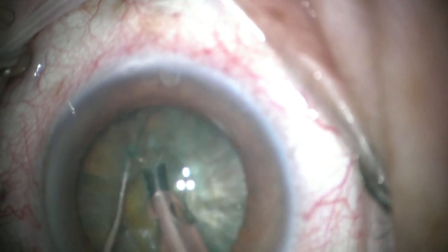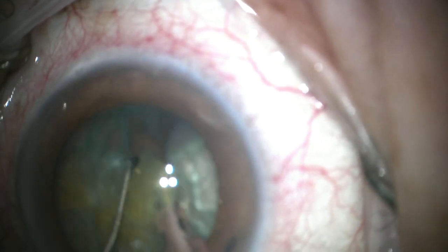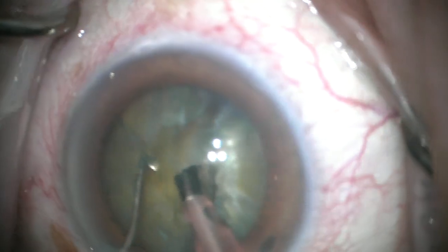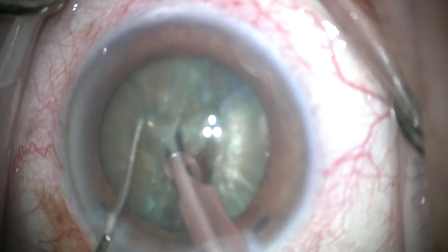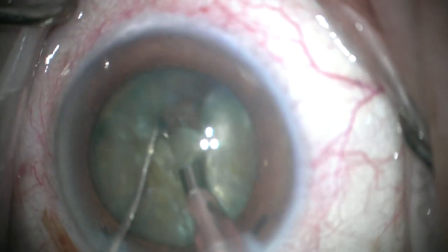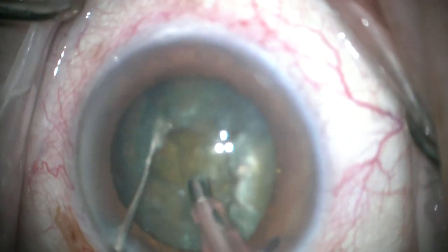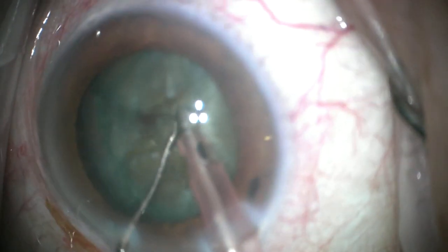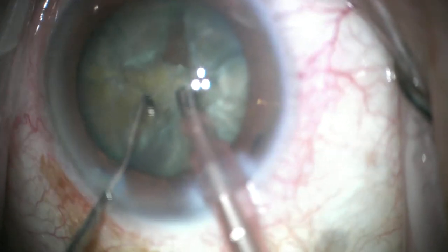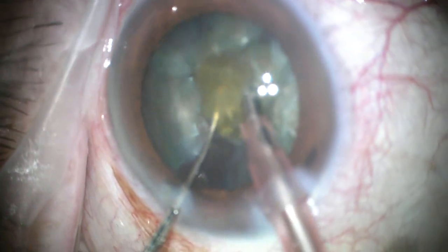Because I like to always remove segments rotating clockwise, I stabilize the larger remaining part with the hook — this is a Hefflager hook made by Moria. I like it because your chopping device does not have to be very long; this one is shorter yet long enough for most lenses. If you have a real thick, dense lens, then I'll go to a Seibel or Conner wand to get behind the thicker capsule. But you can see this fractures very easily, so for most cases I prefer this chopper device.